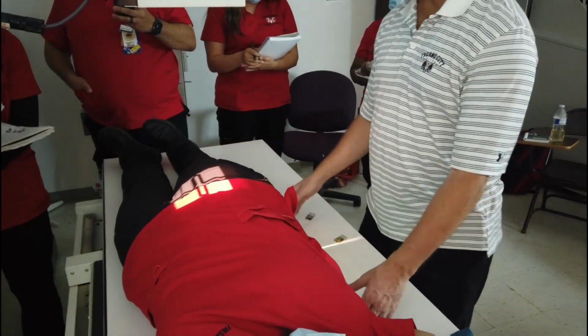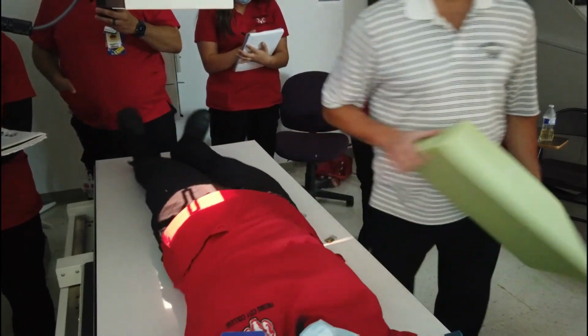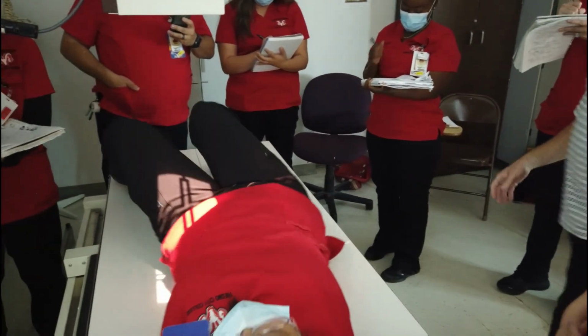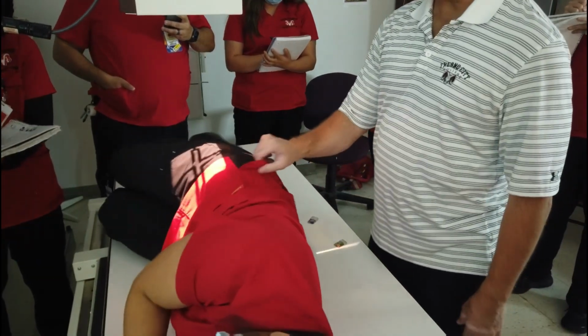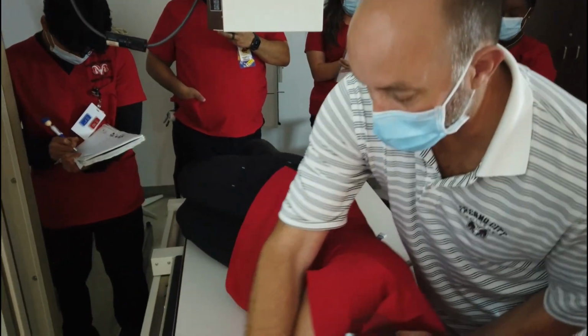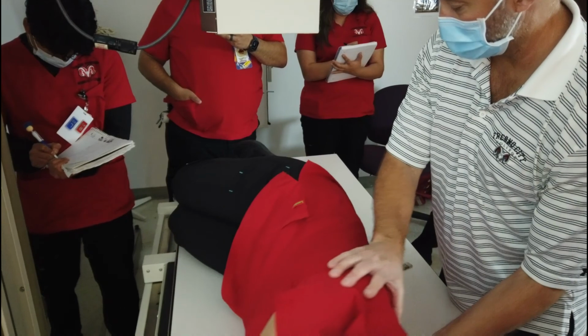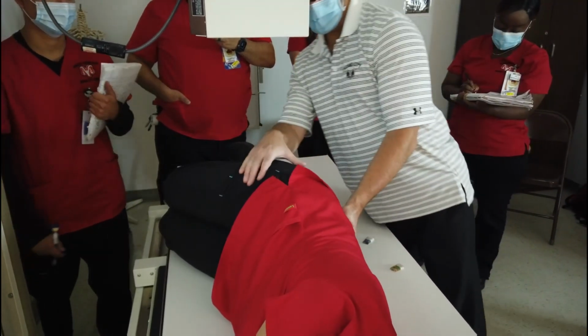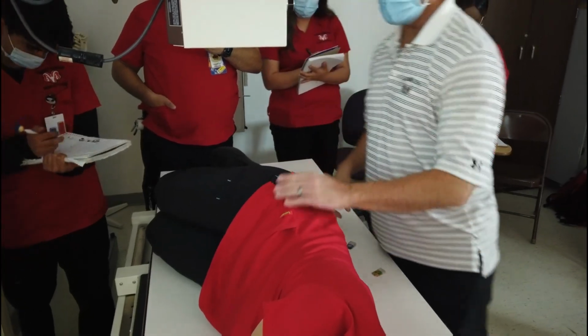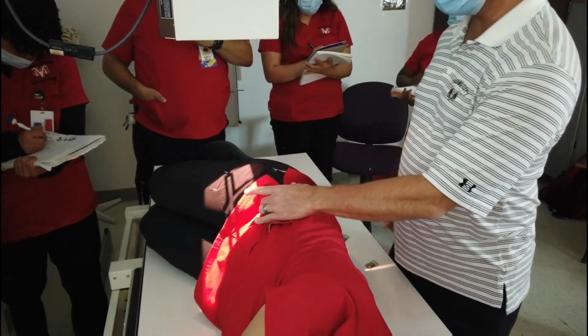Take this, go over to your left side, and then we're going to do a lateral. Your other left. I'm going to take your arms and bring them back this way a little bit, almost like doing a lateral sacrum coccyx. Make sure she's in a nice lateral position. Here's the ASIS right here.